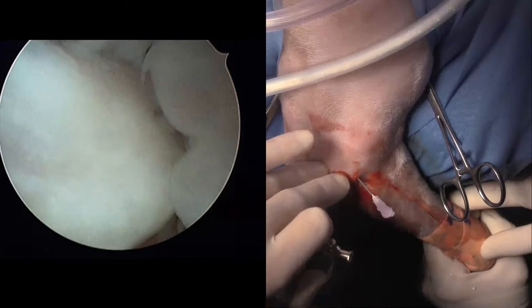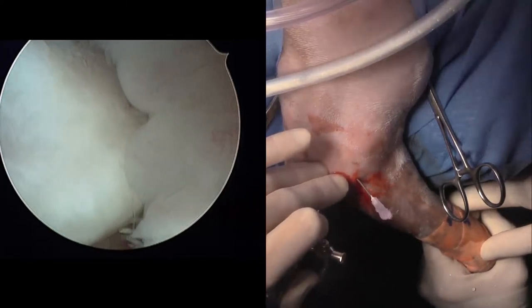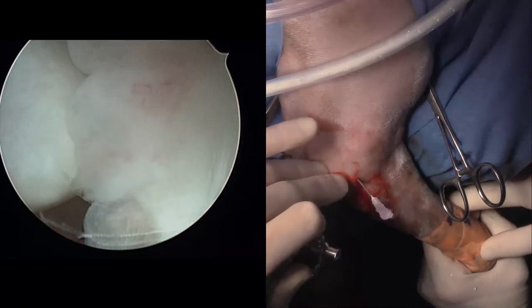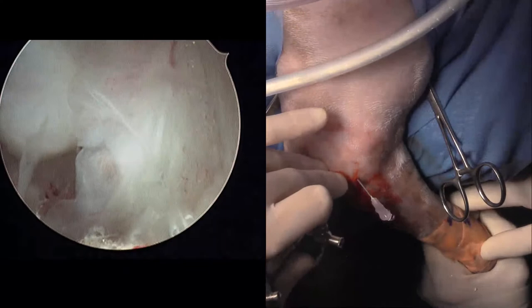Now I need to get a blade. Can you grab that arthroscopy kit there? Yep, bring that out and let's see what we got instrument-wise as far as graspers are concerned. These guys, that's what I need. If you just hand that to me when I need it.